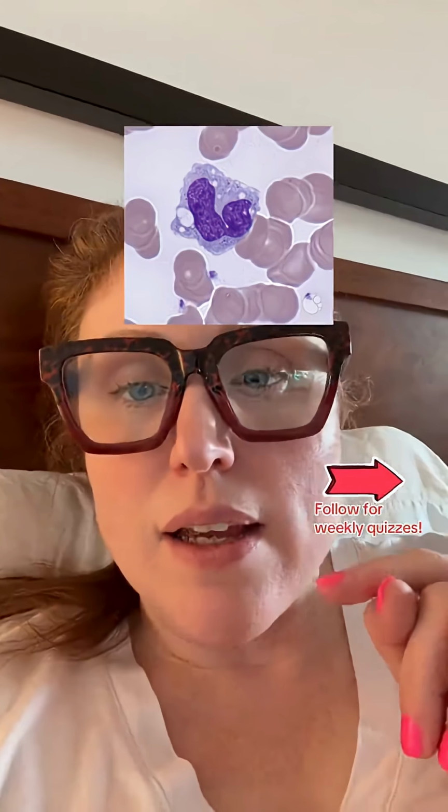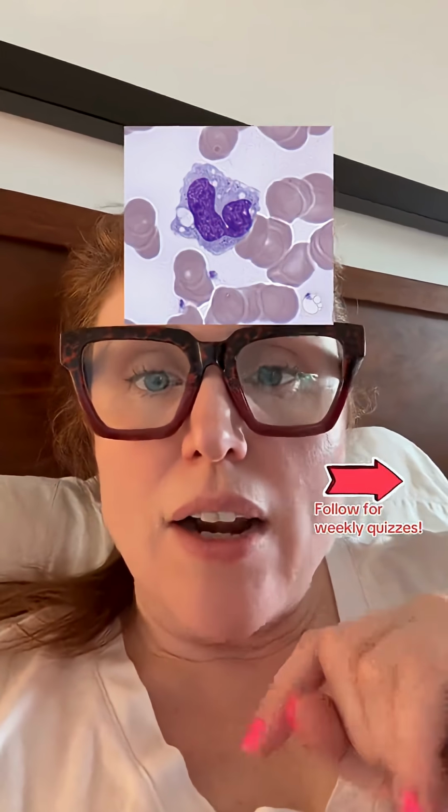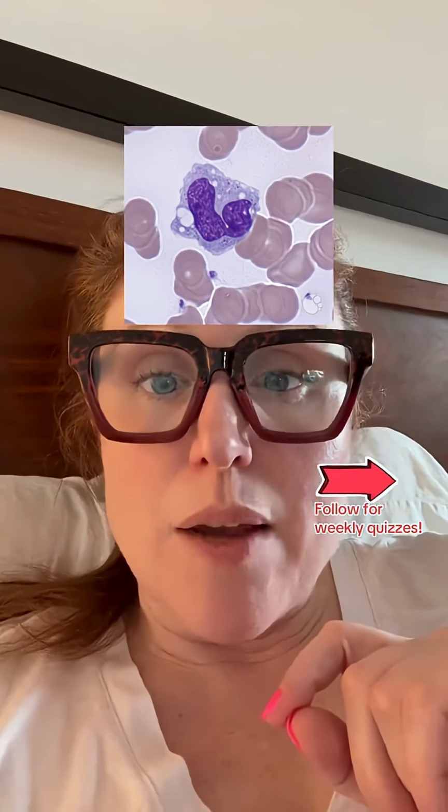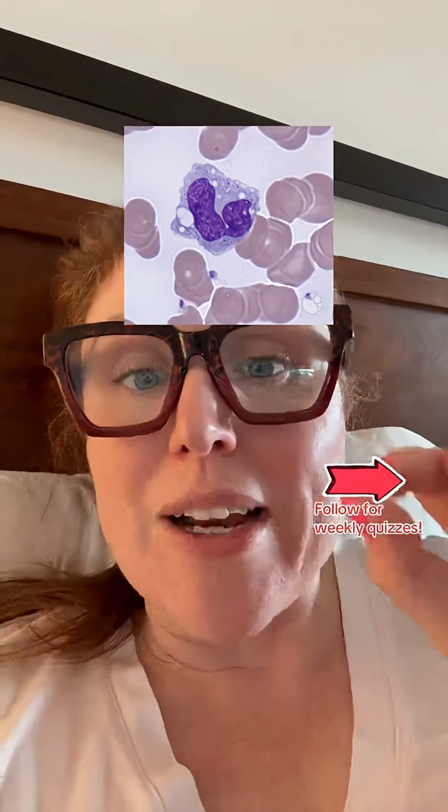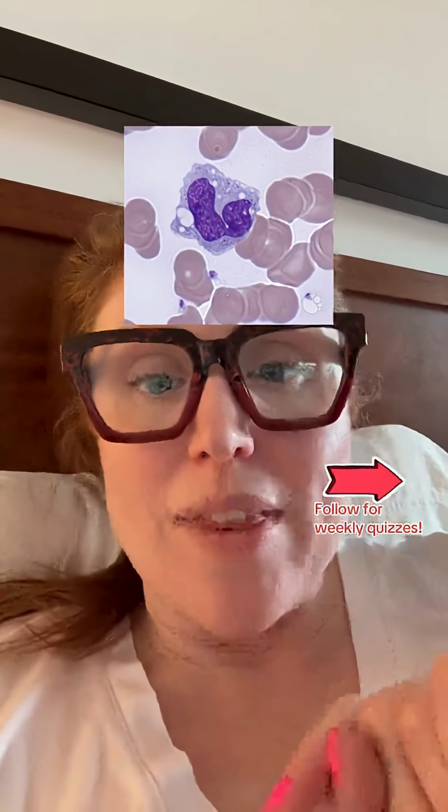Next, I look at the color of the cytoplasm and whether there's any inclusions or granules inside that cytoplasm. This cell has a sort of gray bluish cytoplasm, and you can see some fine granules in there. And most characteristic about this cell when we're looking at normal cells is the presence of those vacuoles. That, I think, is a dead giveaway for this, especially when you're trying to determine whether it is a reactive lymphocyte or what this actually is, which is a monocyte.